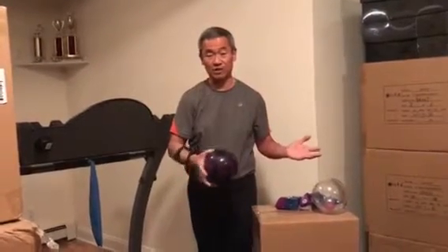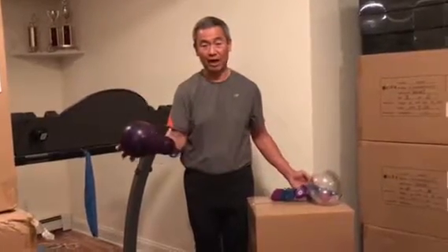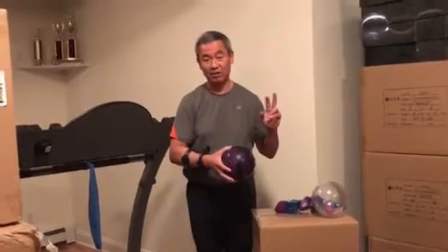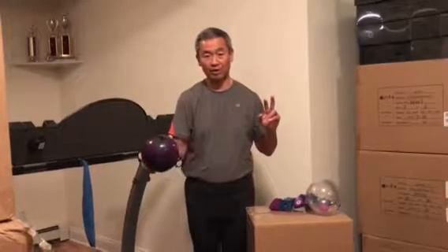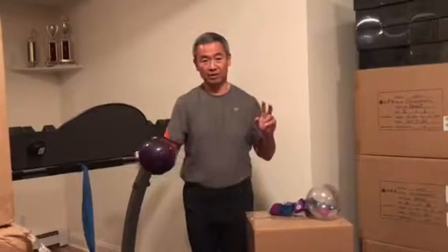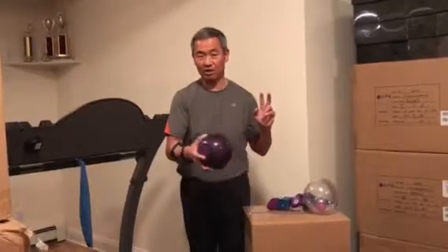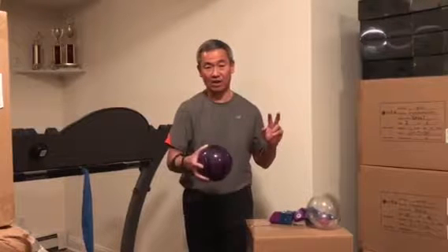So the same exercise, you go external rotation, so the subject will go out to the middle here and come in. But the caveat is that they would rotate this all the time while they're going out and going in. So that's counted as 1, and that's 2. And you can see and hear that the ball is rotating while you're moving. So those are the equivalent exercises.